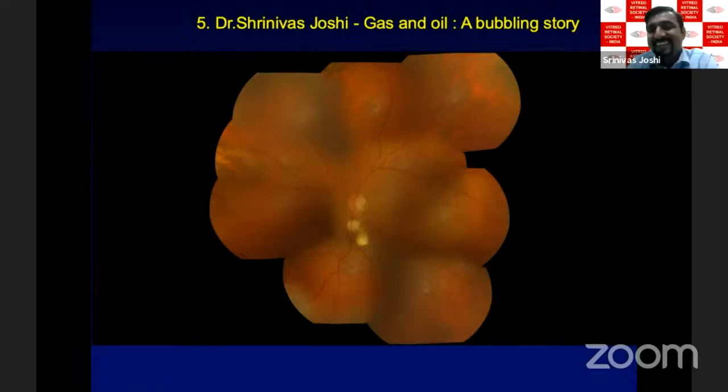That's the thing. You said in between PFCL. When did you use PFCL? If I overheard wrong, you did not mention anything about PFCL? No PFCL use, right? No. I used the PFCL. I tried to see what happened. The bubbles which were coming posteriorly, I had to push them to the mid-peripheral area and then did a retinotomy. So that is where I used the PFCL, in the first surgery.